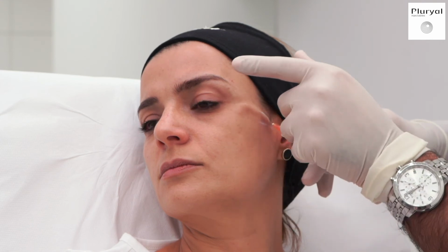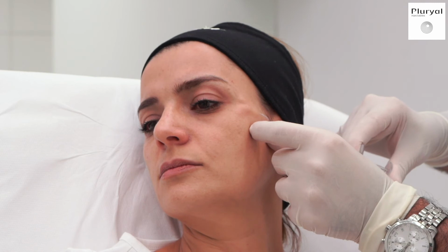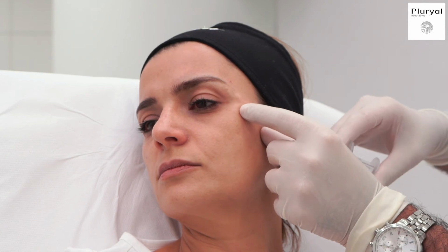I always try to blend the temporal area with the cheekbone. Here the patient has a scar on her orbital rim.